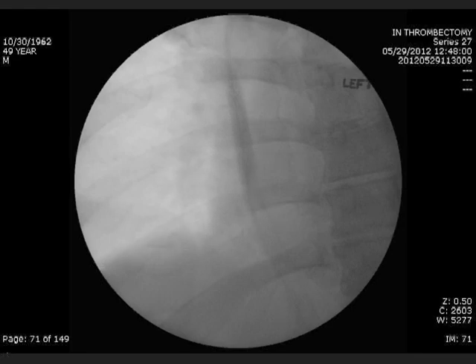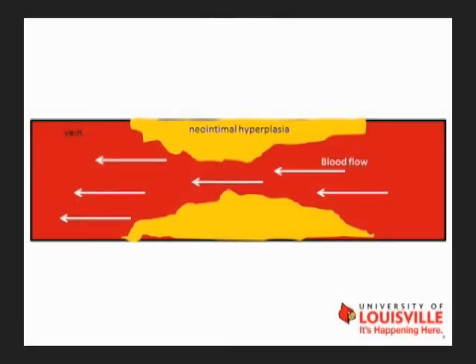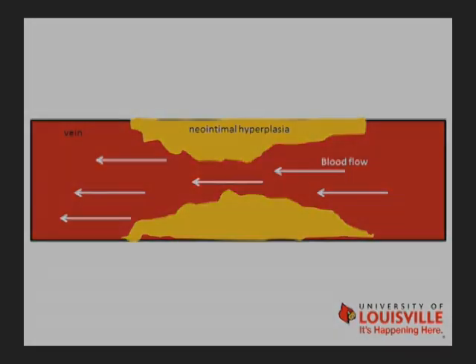Why do appropriately sized stents still migrate in hemodialysis vascular access? It's recommended that stents in vascular access are oversized at least 2 millimeters from the nearest normal sized vein distally. In the last two cases, I appropriately increased the size of the stents by 2 millimeters and both stents still migrated proximally. In hemodialysis access, the blood flow in the central venous system can get up to 2.5 liters per minute. Stents migrate because there is an anatomy issue with veins getting larger and a flow issue with the tremendous flow in a vascular access.